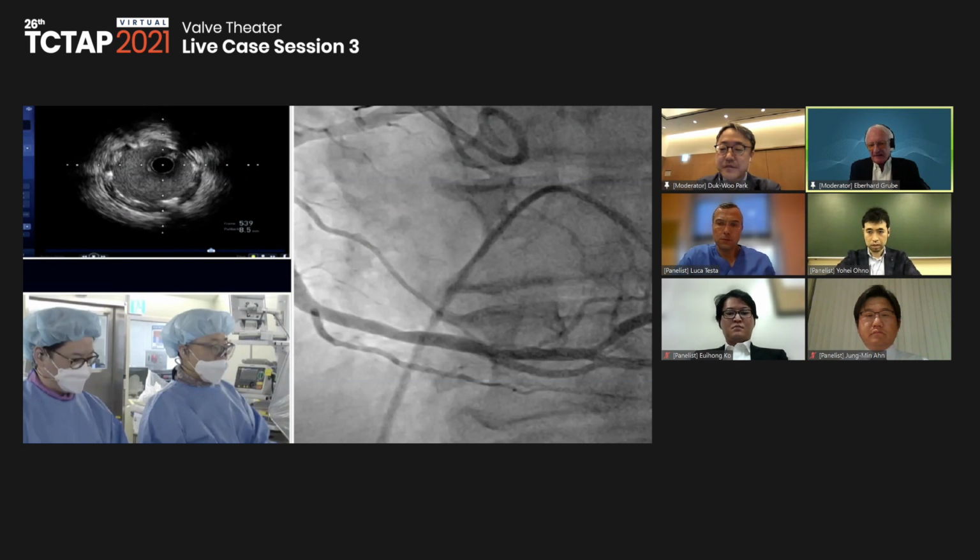The other thing you might consider if you don't do TAVR, I know some centers will do balloon valvuloplasty only in order to bridge to a later stage. But given the success of TAVR, particularly in your center with your experience, I think this is a very reasonable approach.